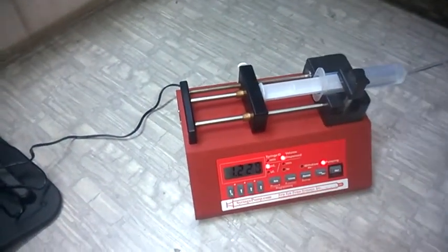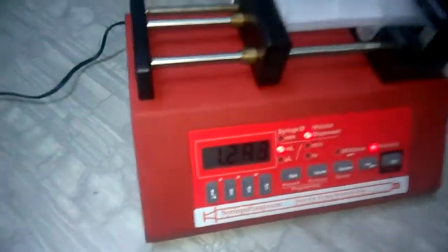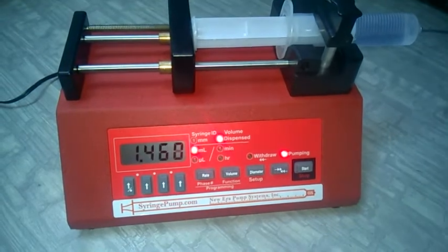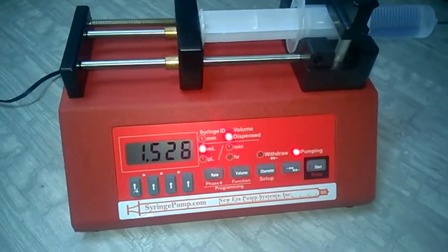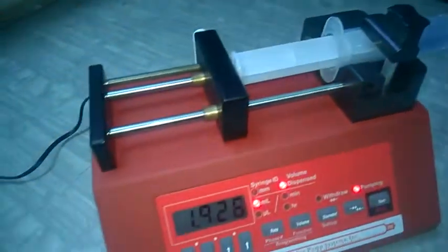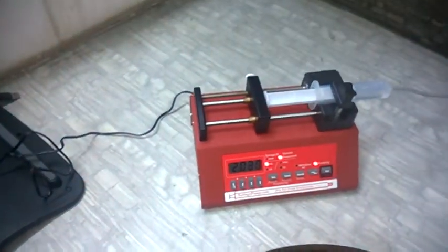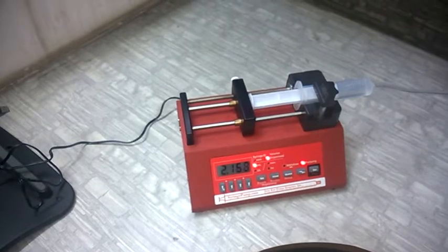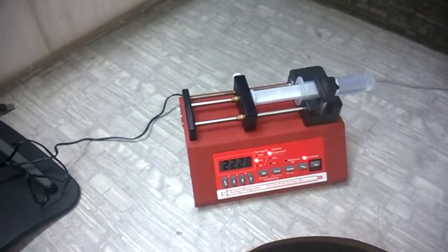This machine will keep running until you stop it manually, as it has no programming. If you want the pump to stop automatically at a set volume, you can go for the higher version — the NE1000 model — where you can also set the target volume. You can see it is flowing and infusing. I hope this demo video helps. If you have any queries, please feel free to contact Uni-Genetics. Thank you very much.